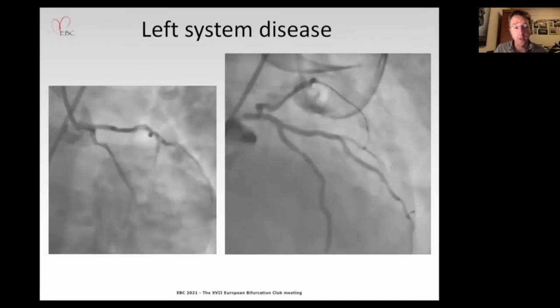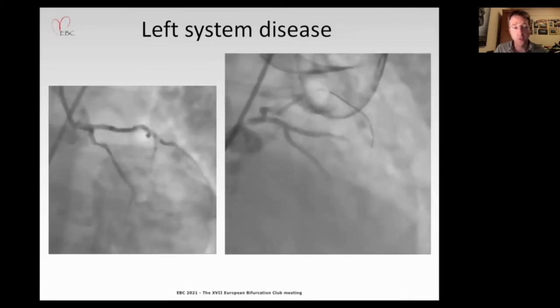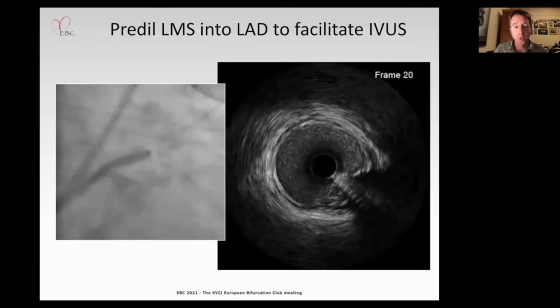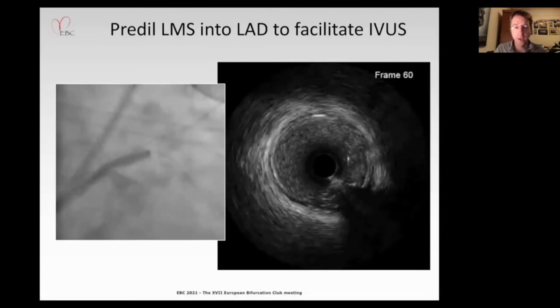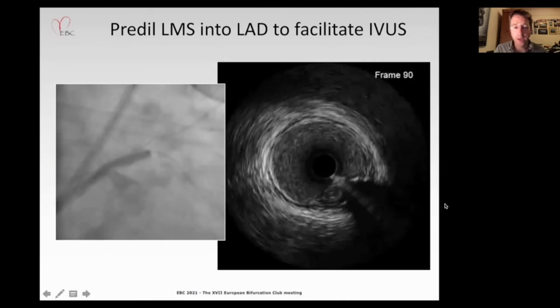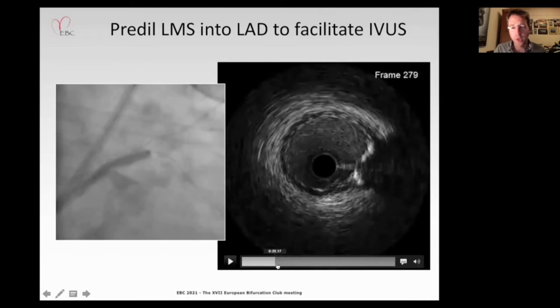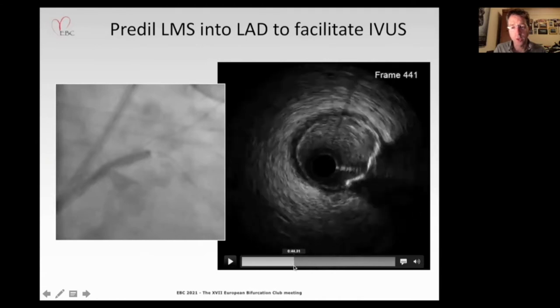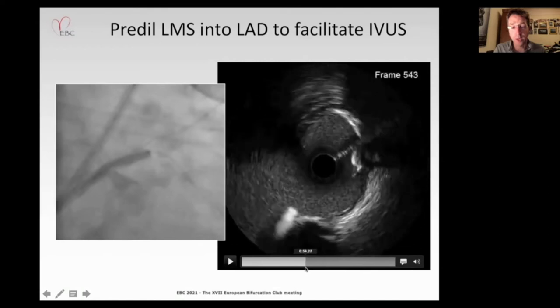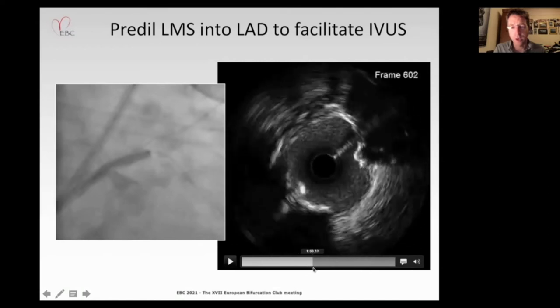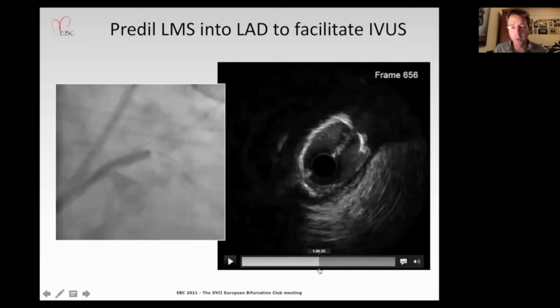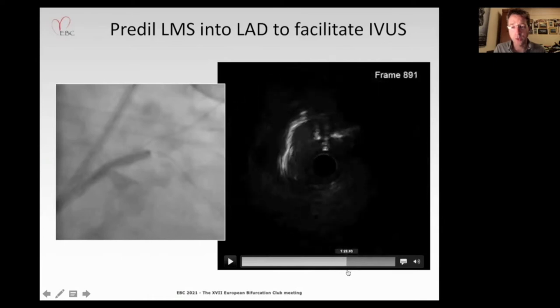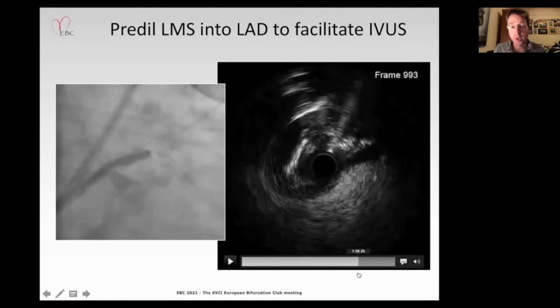This is her left coronary disease at the time of intervention, showing an exquisitely tight ostial left main associated with very high burden calcification in the aortic root. A guide catheter is carefully introduced with flotation of a wire firstly into the circumflex and then down the LAD. Pre-dilatation is undertaken just to stabilize the catheter, and then IVUS is performed from the LAD back into the left main.